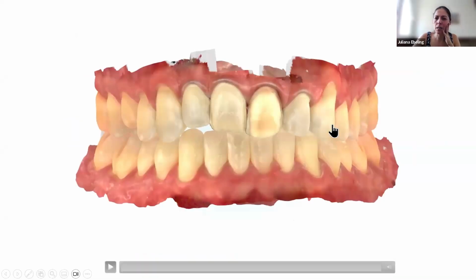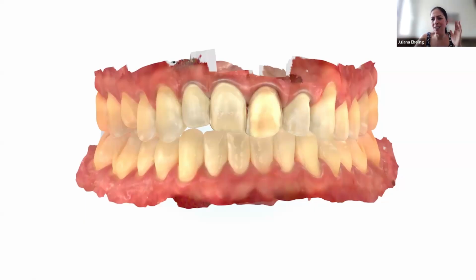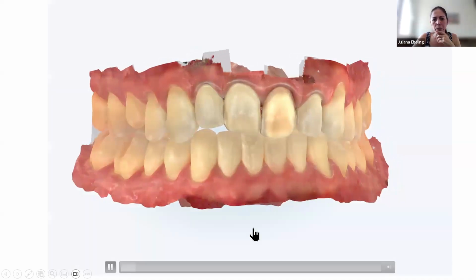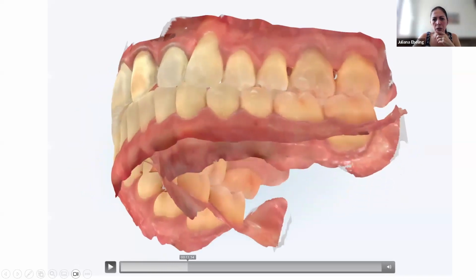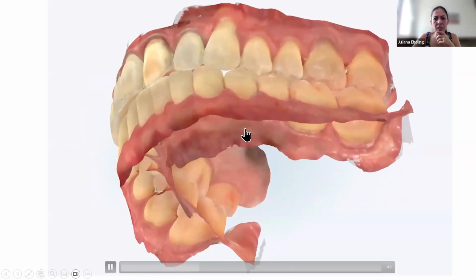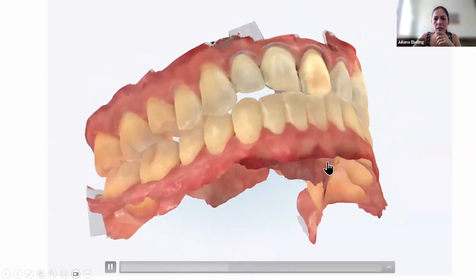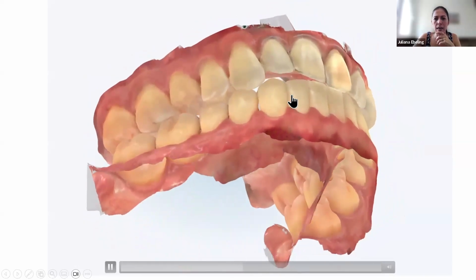And this is after the esthetic phase for crowns. Here we negotiated the esthetics for this tooth because the structure of this tooth is very compromised, and then we decided not to wear a lot of this structure, to preserve it. And then a good relationship between teeth, guidance, and now we are looking for a better anterior guidance.